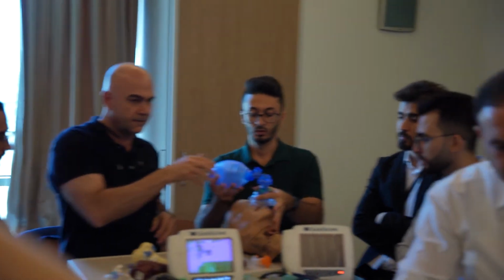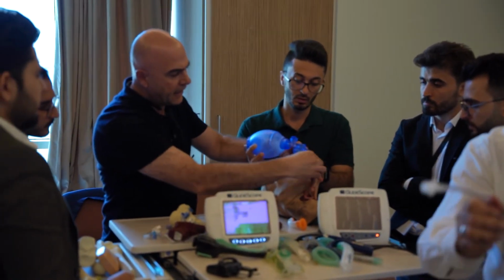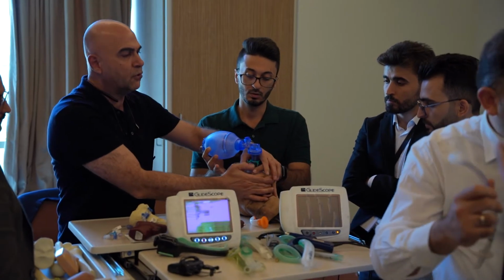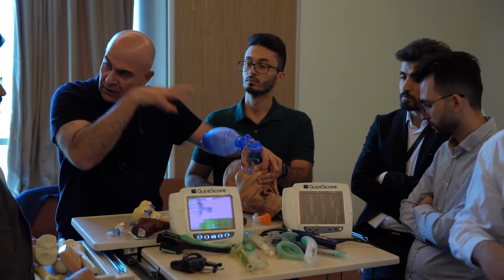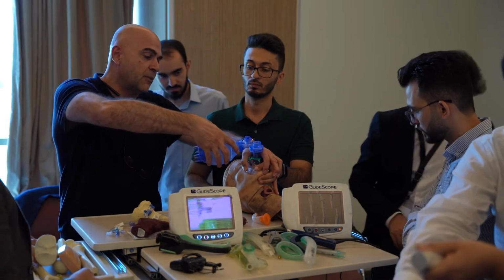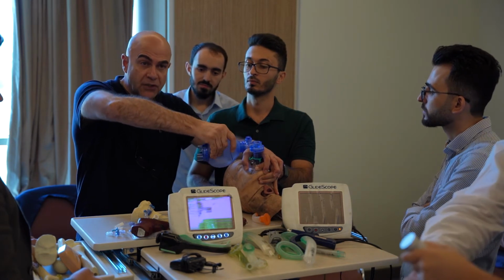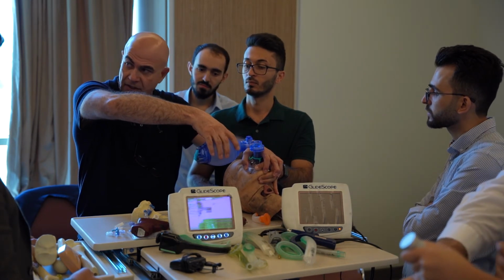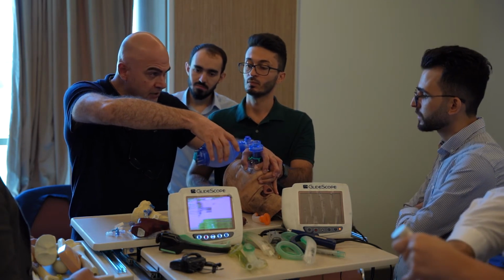Show me again. Can you try and flip? No, it's fine. C here, and these three fingers you are going to hold. You are going to control the mouth of the patient with your non-dominant hand, while the other is the dominant hand. The ventilation will not be full ventilation. It is half ventilation, which should be within 1 second. Half ventilation within 1 second.